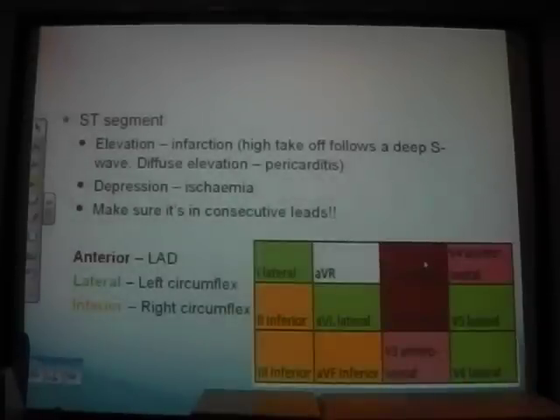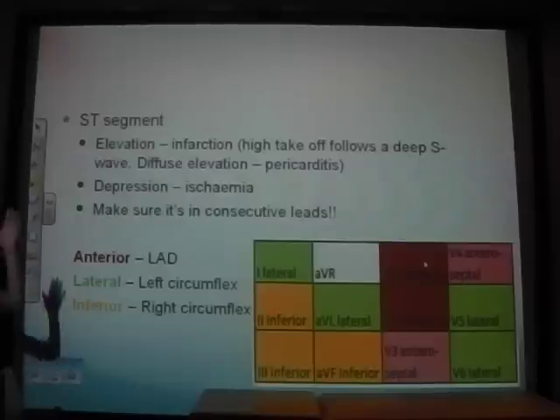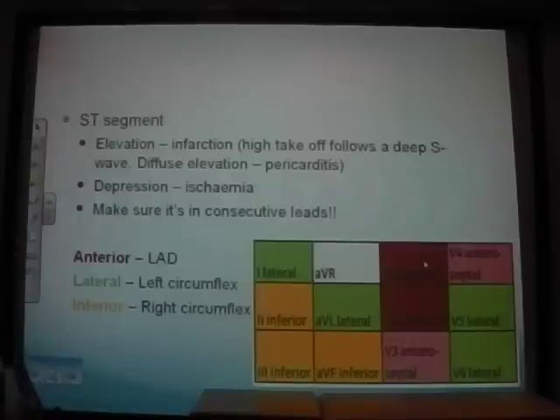Talking about ST segments, which are very important. I've got up here the different territories that you will see within the ECG. Leads 2, 3 and aVF are your inferior leads. V5, V6, 1 and aVL are your lateral leads, and then anterior V1, 2, anteroseptal / septal 3 and 4. So you'll need to look at your ST segments. First of all, is it elevated?